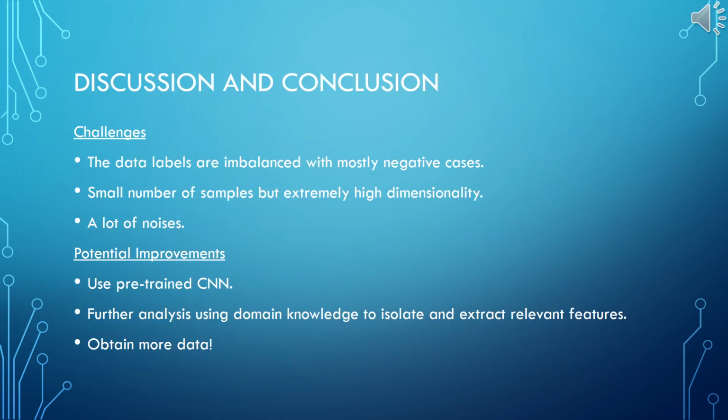This lung cancer classification is a hard problem. Some of the classifiers we saw previously had trouble predicting positive, as we only have 26% positive cases in the dataset. Also, the dimensionality is huge while the training sample is small, rendering the models prone to overfit. And the inputs are noisy even after masking. The noise can include the small intestine and lower abdomen, air bubbles, blood vessels, and anything that is basically not cancerous nodules.